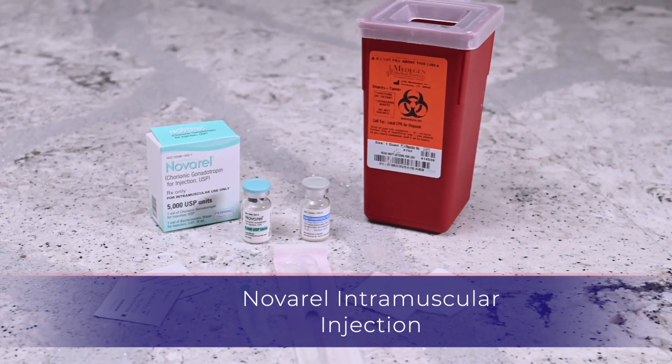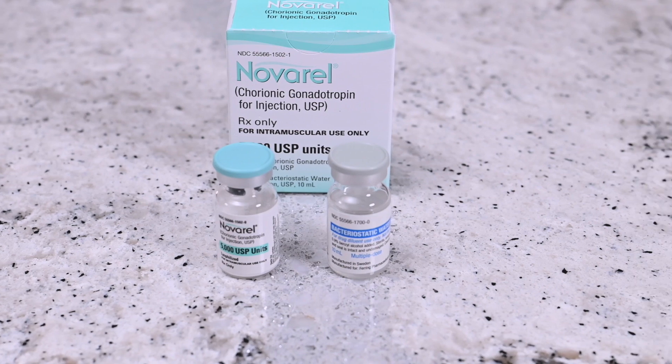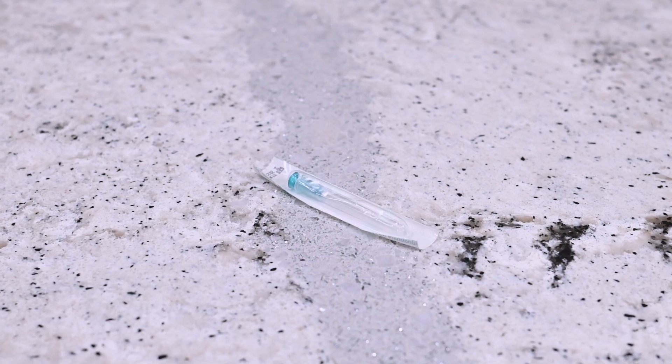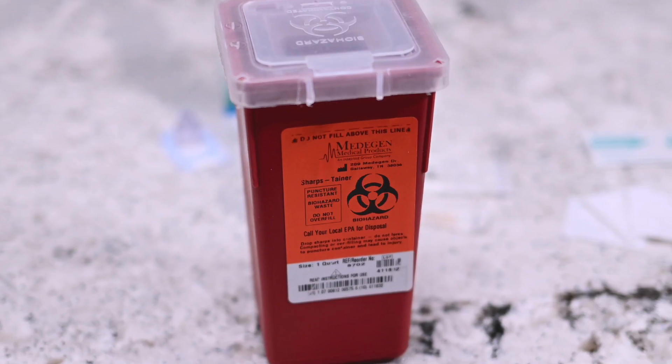You will need the following: vial of Navarrel powder, vial of Navarrel solvent, syringe with attached needle, 23 gauge intramuscular needle, alcohol prep wipes, gauze, and sharps container.